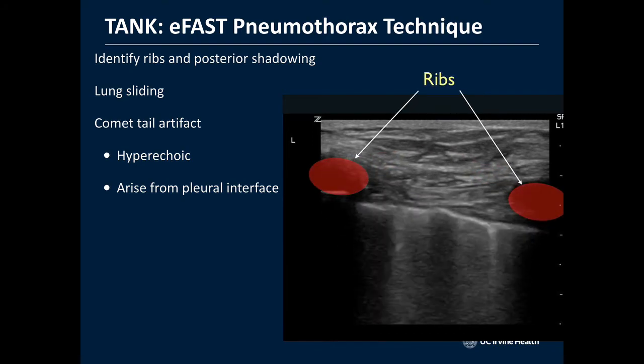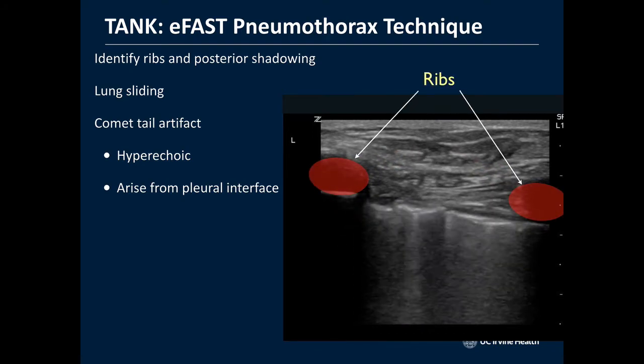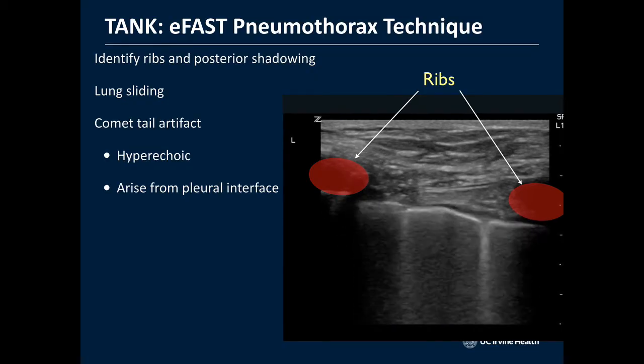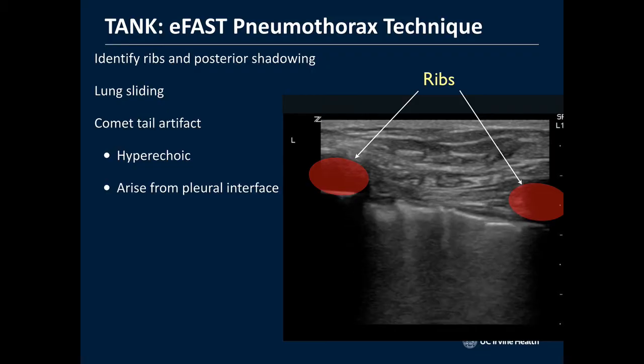So again, the technique is a sagittal plane. The indicator is towards the patient's head. That's the most common question I get about doing a pneumothorax exam. Which way to aim the probe again, Dr. Fox? To the right, to the head? Yeah, towards the head, sagittal view.